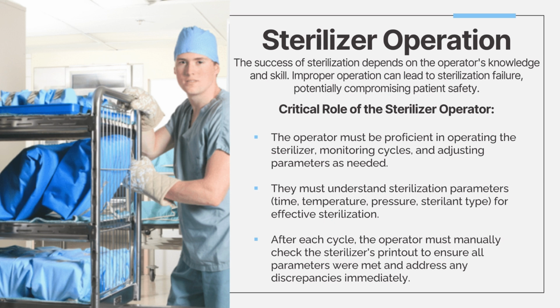again for safe reuse. And of course, you would have to remove all the indicators. You have to change up all the tapes just so there's an accurate reading on the second try, on the second cycle, right?